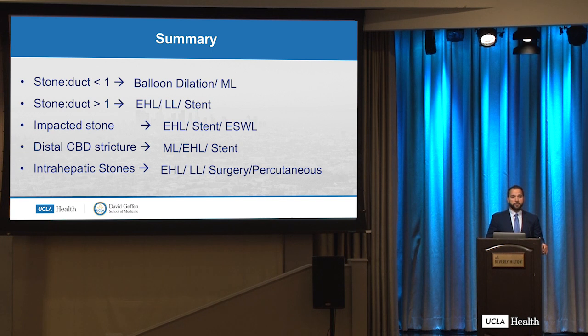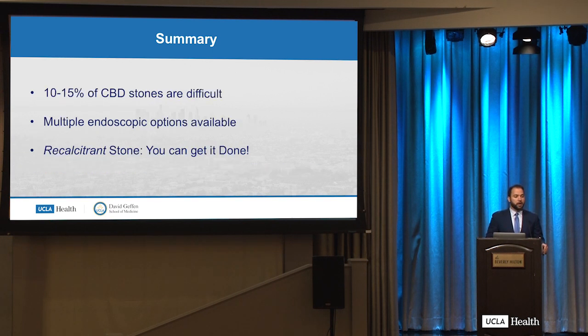So in summary, ERCP is the standard of care and usually successful. However, 10 to 15% of CBD stones tend to be difficult. We have multiple modalities, and endoscopic options are highly successful. And even for recalcitrant stones, you can get it done. Thank you.